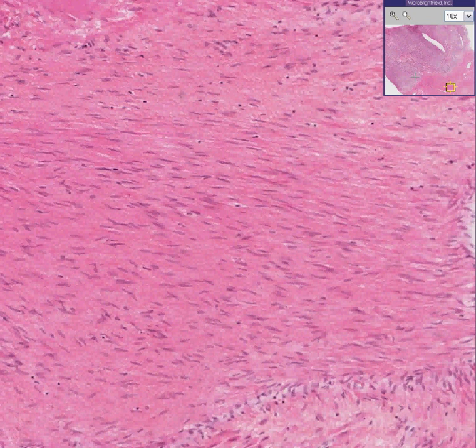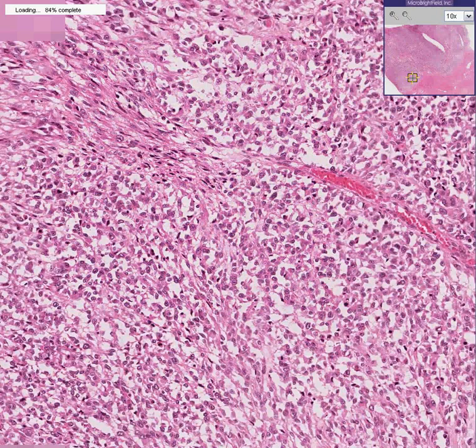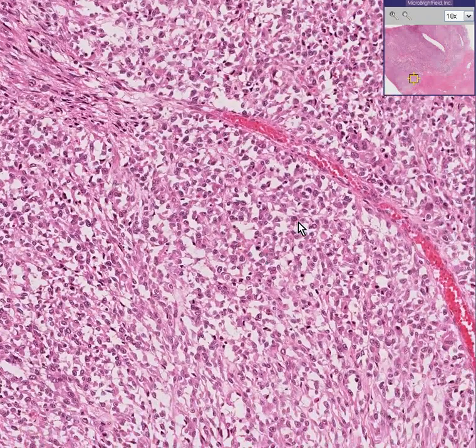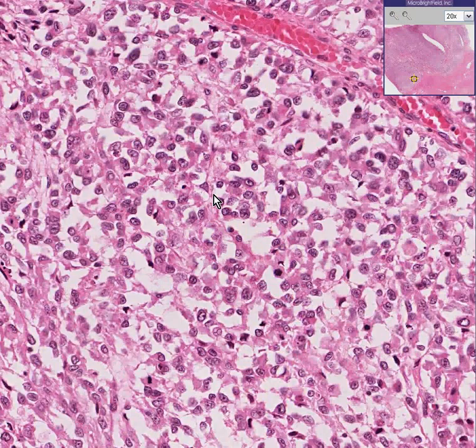Now let's move into the so-called smooth muscle tumor. First of all, notice they don't look terribly normal. Some of them do — nice and spindly — but some of them look like their nuclei are just a little bit too big relative to the cytoplasm. And in addition, if we counted 10 fields here, we would find a lot of mitoses.